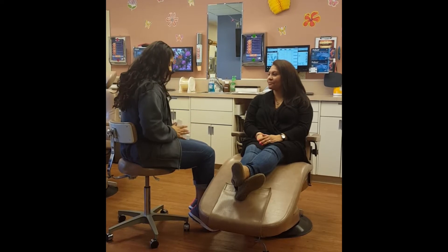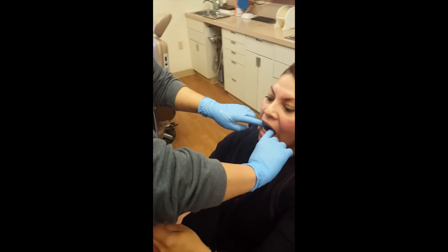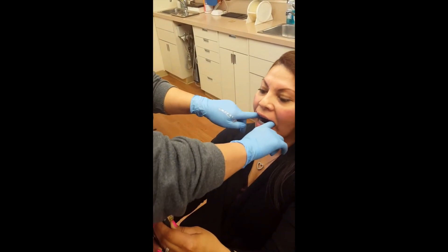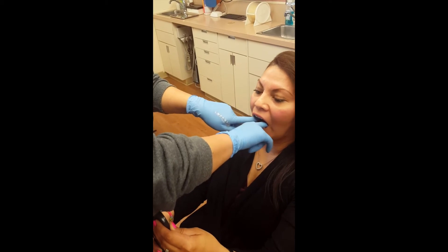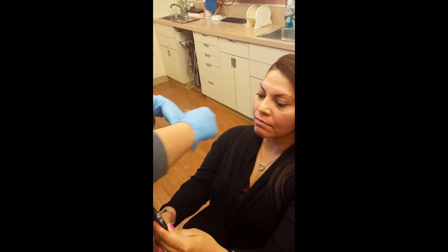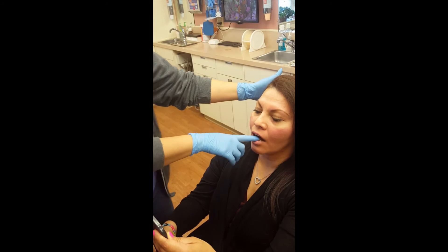I'm going to place them in your mouth here. I'm going to find where your teeth are, and then I'm going to start with finger pressure here all the way to the back. You never want to bite them in — you always want to just do finger pressure. So then I'm going to go ahead and start with the top one as well. I'm going to place them up here and do finger pressure. That's pretty much how they go.